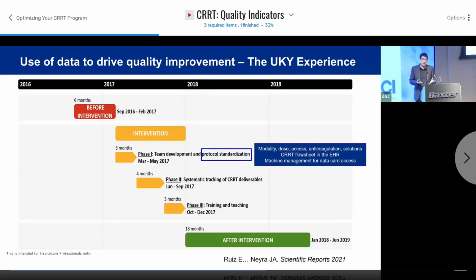So in one of the faculty meetings, I asked if there was any preference for people prescribing CVVH versus CVVH-DF, what's the reasoning behind it, and so on. So we agreed as a practice that we're going to prescribe from now on CVVH-DF, for the purpose that we don't want to confuse the nurses. CVVH-DF gives us more flexibility, has an extra pump that you can use, and we decided together that CVVH-DF will be our standardized protocol.